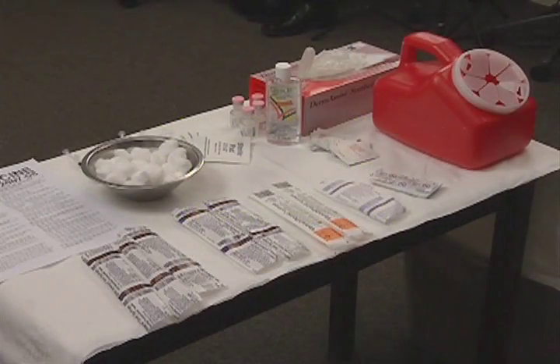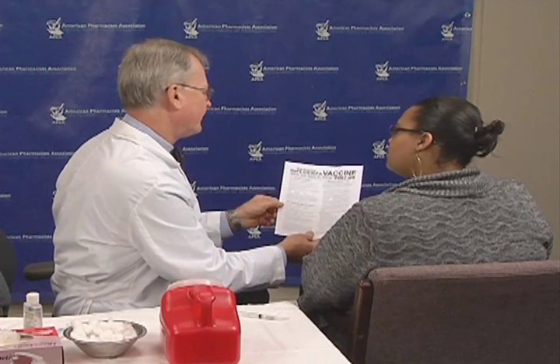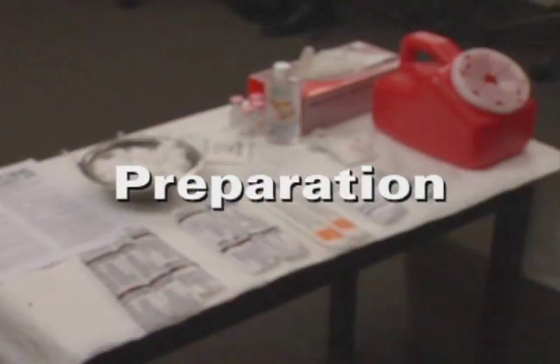Set up your supplies in a private or semi-private area that includes a chair and workspace for patient comfort and safety. Arrange the physical space to allow for fainting without injury, plus access to a hard surface if CPR is needed. Provide your patient with the vaccine information statement as required by law, review any applicable screening questions, and ask if he or she has any questions about the immunization.